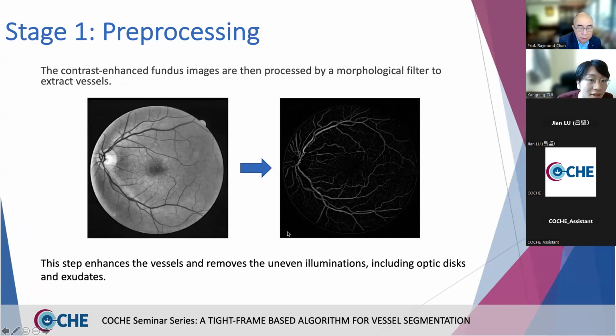So here, this is an optic disc, and you can see some small dots in the retinal image as well. Those are what we call exudates, and exudates are one of the signs of diabetic retinopathy, which is caused by diabetes and is also related to some CVDs. So basically we take the vessels from the image. This is what we did for the pre-processing.